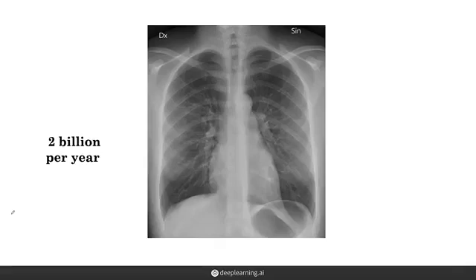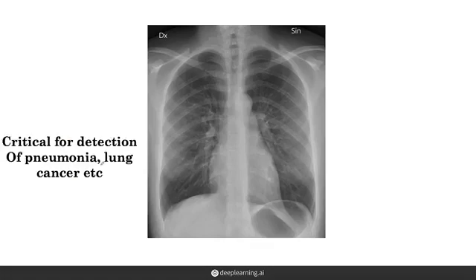The chest x-ray is one of the most common diagnostic imaging procedures in medicine, with about 2 billion chest x-rays taken per year. Chest x-ray interpretation is critical for the detection of many diseases, including pneumonia and lung cancer, which affect millions of people worldwide each year.